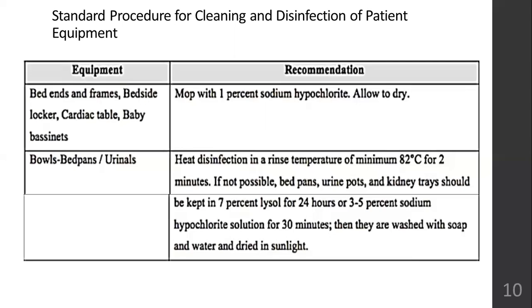Then bed ends, frames, bedside locker, cardiac table, baby bassinets. Okay, what should you use on these areas, because these parts also touch the patient's body, right? So you can wet wipe them with 1% sodium hypochlorite, allow it to dry, and then it can be used by the patients.